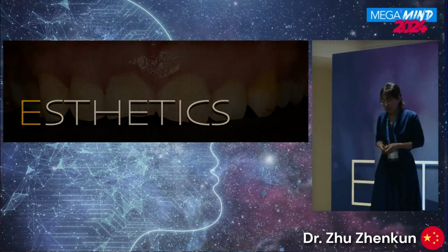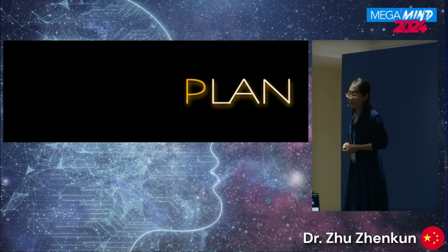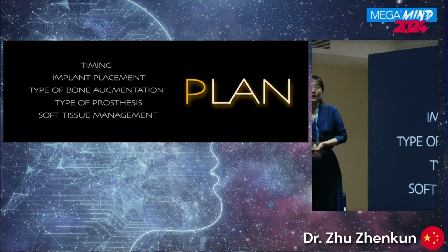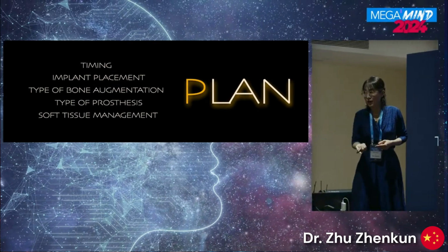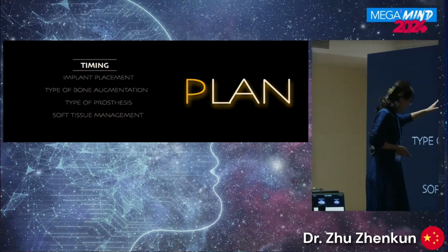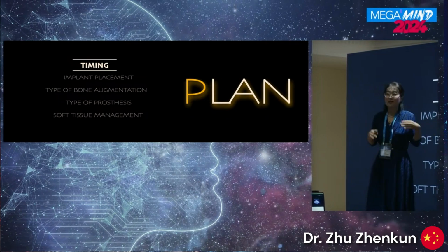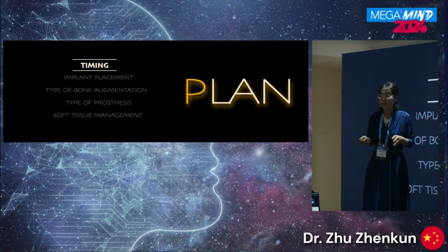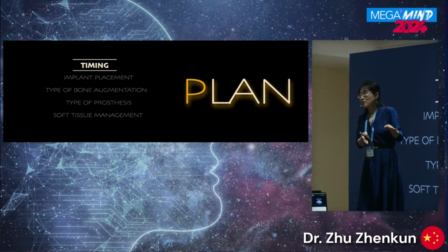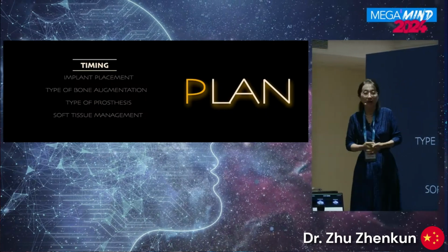For this kind of patient, the first thing we need to do is make a good plan. There are 5 keywords we need to consider when we plan, if we want to achieve good or better aesthetic results. The first is timing. Immediate implant placement is defined as inserting the implant into the extraction socket immediately after the tooth extraction.